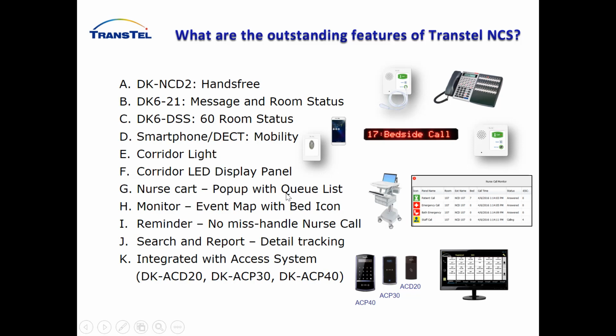So we categorize this kind of queuing list and put it on here. Monitor: if people need more detailed information, not only the number of the room but where the room is and what kind of nurse status, we can use icons, bed icons and status icons, to show on the floor map at the nurse station.